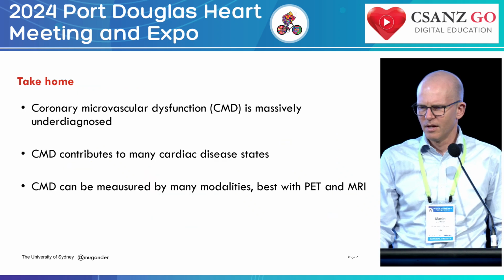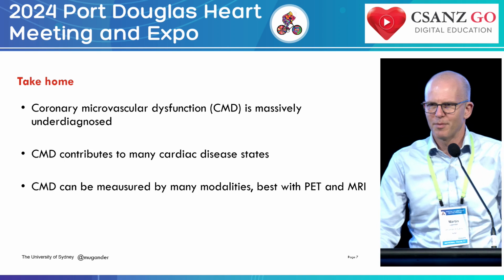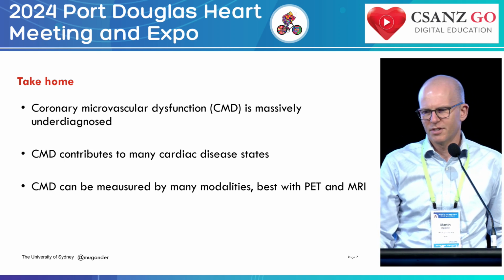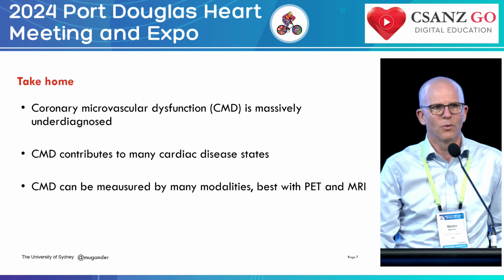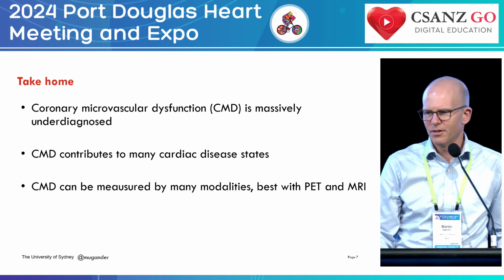So in summary, because we had a limited amount of time in this little rapid fire session here, coronary microvascular dysfunction is massively underdiagnosed. We don't have necessarily all interventionists willing to put down a wire and add the hardware necessary to diagnose.